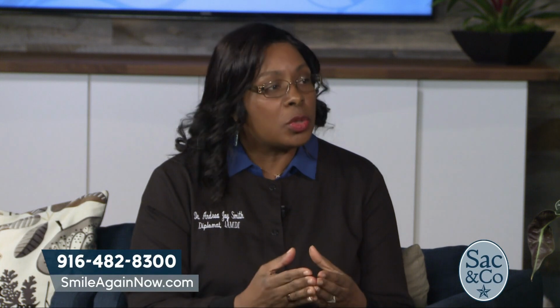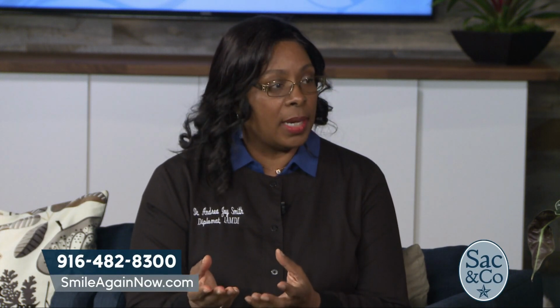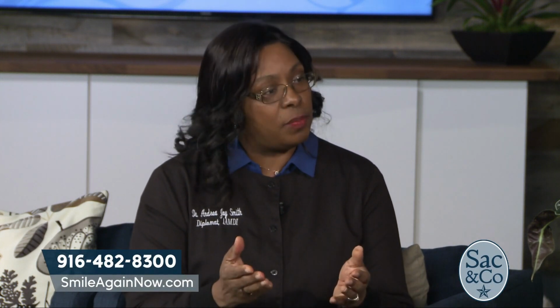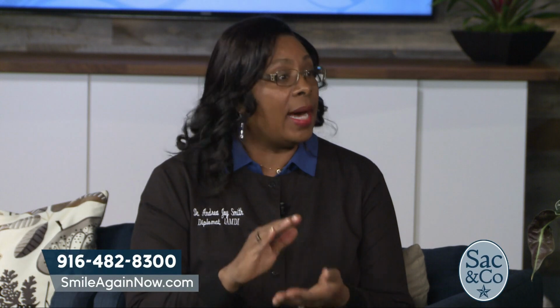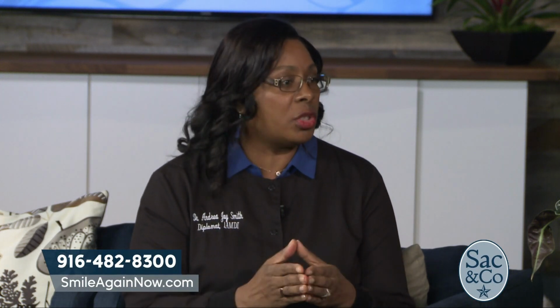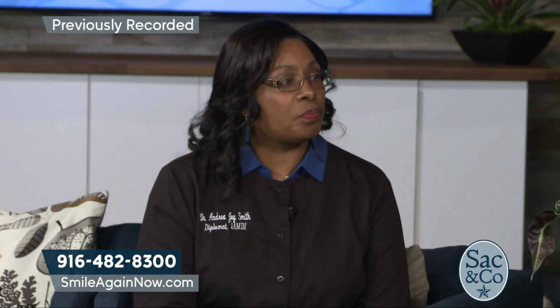So let's talk, though, about the experience. What can someone expect when they come to your office and they're interested in this? Sure. When they come to my office, we'll first do a consultation because we need to figure out whether they are a candidate. We need to look very closely at the bone that's available. So we do a cone beam computerized tomography scan, or a CT scan, and that lets me know the width of bone that I'm dealing with and the height of bone that I'm dealing with. And it also allows me to avoid any vital structures like the nerves or the sinuses when we're placing implants. Okay, and let's talk about the procedure itself, too.